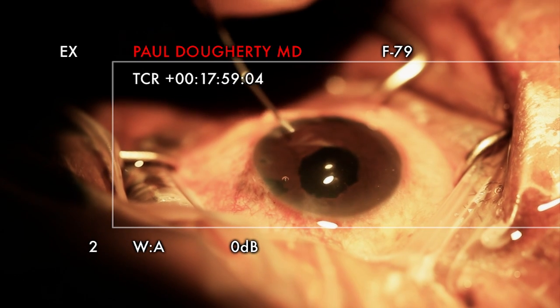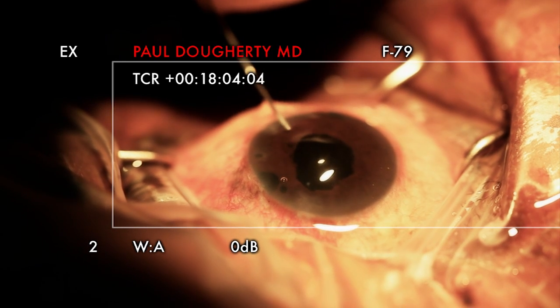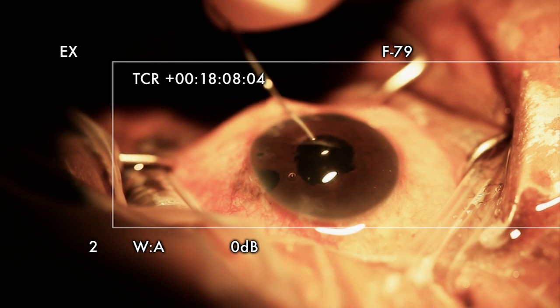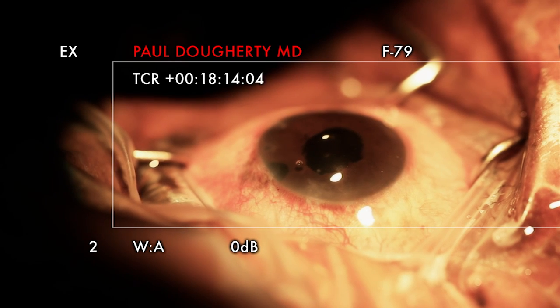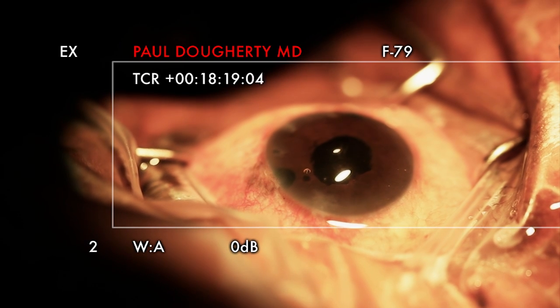I'm going to leave her a little soft just to make sure, and I think I got all the cortex — pressure's elevated. A little more BSS. Go for it — we're basically done.